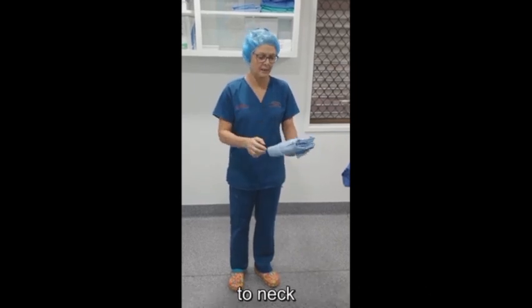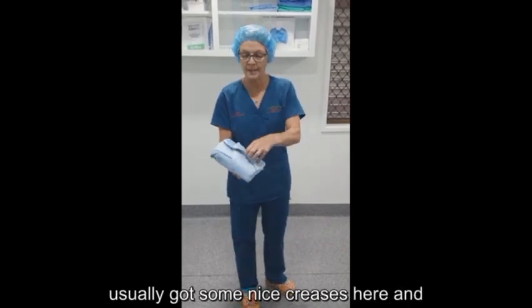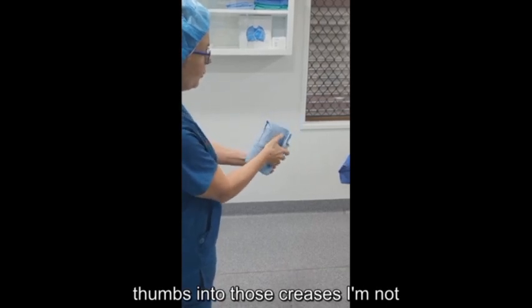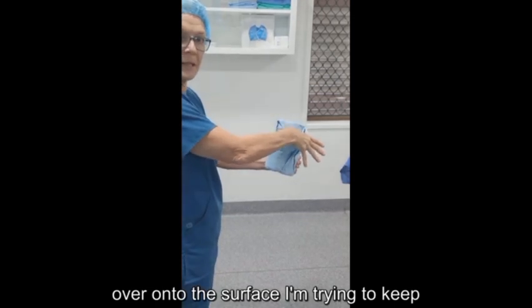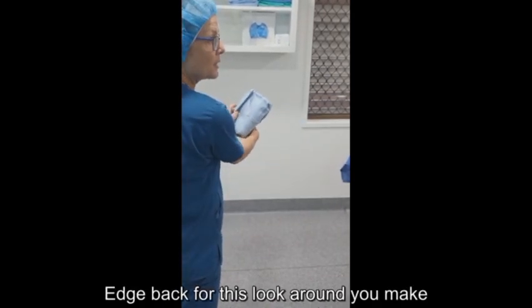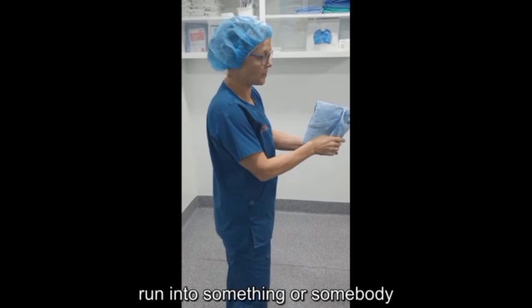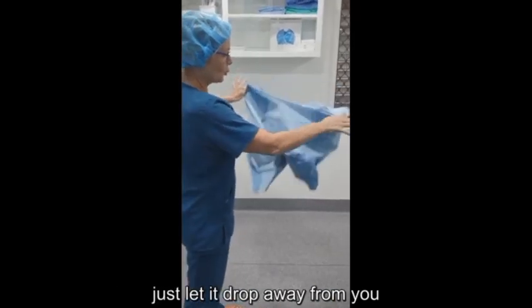So neck to neck. When you first open the gown, they've usually got some nice creases here and here. So I'm going to be putting my thumbs into those creases. I'm not putting them over the front of the neckline because then my thumb's coming over onto the surface I'm trying to keep sterile. So thumb into that crease, thumb into that crease. Look around you, make sure you've got space, that you're not going to open your arms up to get in and run into something or somebody. So thumbs are in there pinching and you just let it drop away from you.